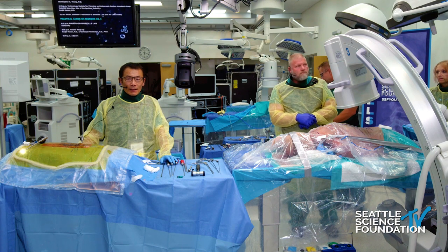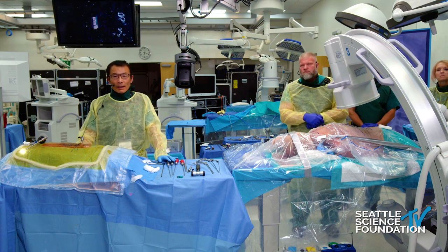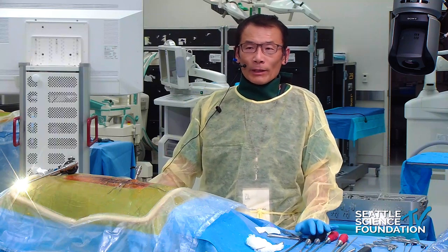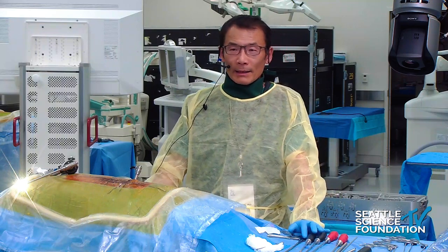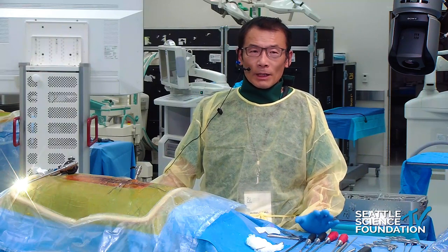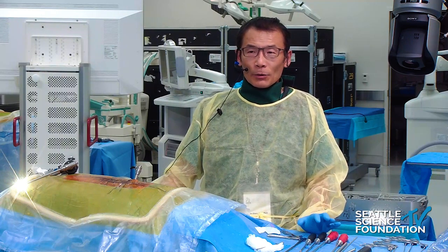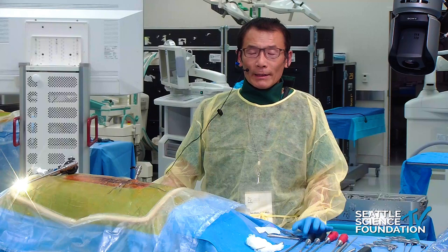Endoscopic fusion is a workhorse for me, especially for the L5-S1 level. I use interlaminar, which is a PLIF approach, usually when you need dorsal decompression. It's either bilateral or unilateral, but most times we do bilateral decompression. It's the same concept that we have been talking about during the course. It's a unilateral approach, bilateral decompression. You can carry the decompression all the way to the contralateral foramen. You can also drill the contralateral pars to have a very good release posteriorly.